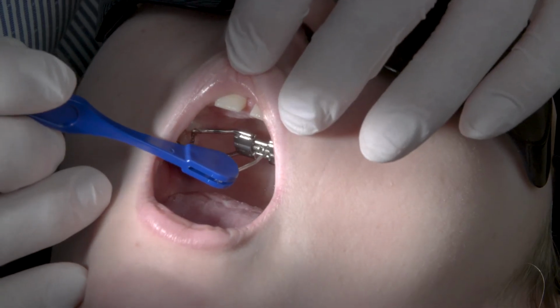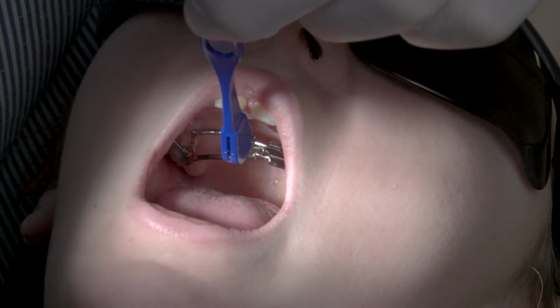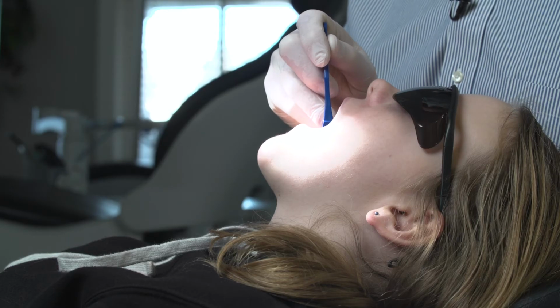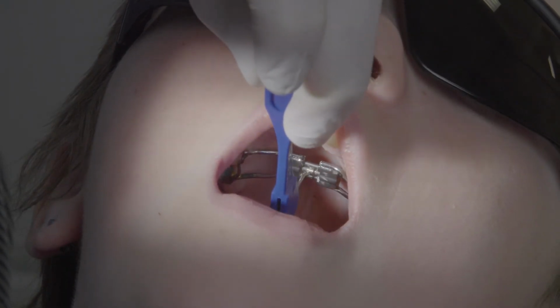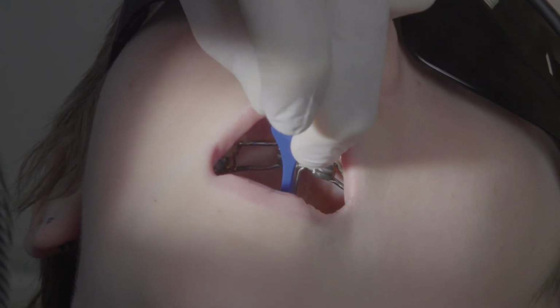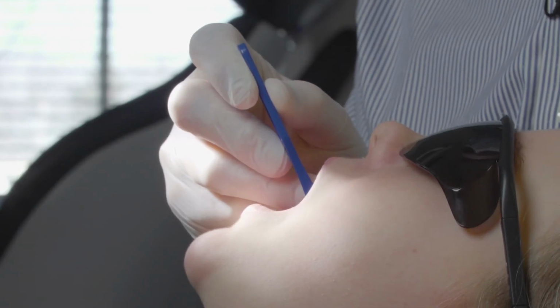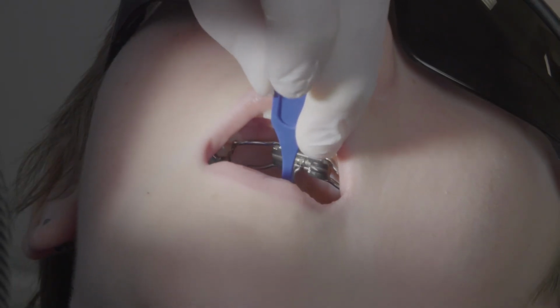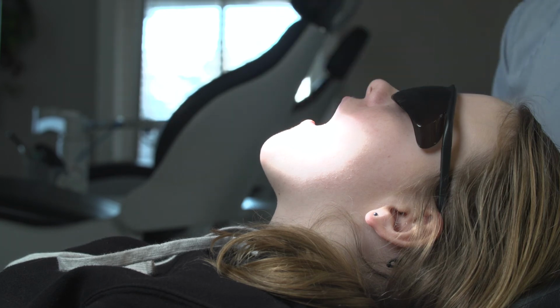What you want to do is insert the key into the hole with firm pressure. Remember that there's a bend in the key that will prevent you from pushing it too far. Now that the key is inserted, complete your turn by pushing the handle towards the back of the mouth until you can't go any further. Make sure you can visualize the next hole ready for a turn the next night, and remove the key with gentle pressure towards the back of the mouth.